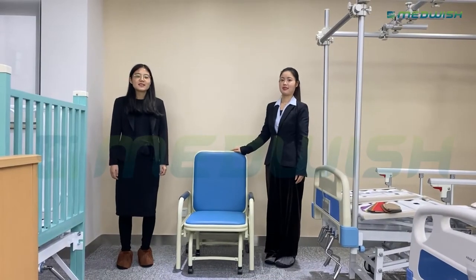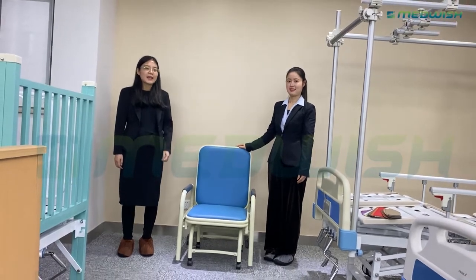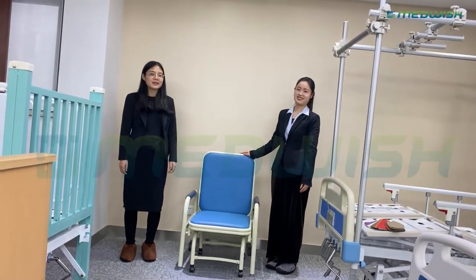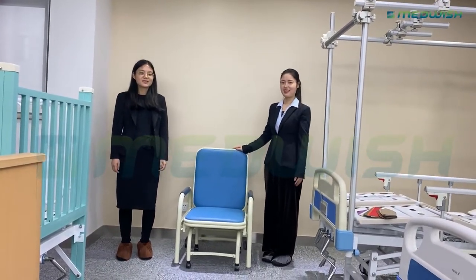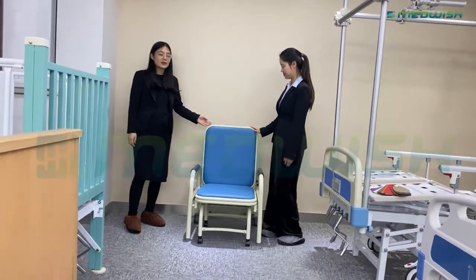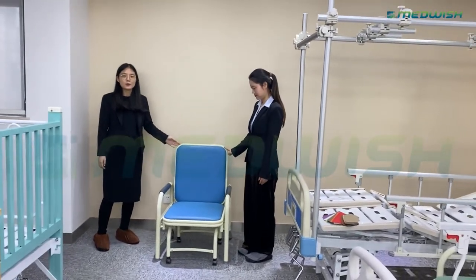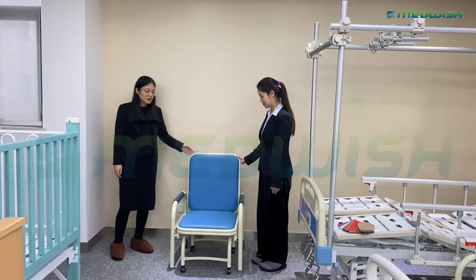Hi everyone, today we are glad to introduce our company chair for you. This is my colleague. Hello everyone. First, let us see this economic company chair, suitable for the patient ward room or the company room.